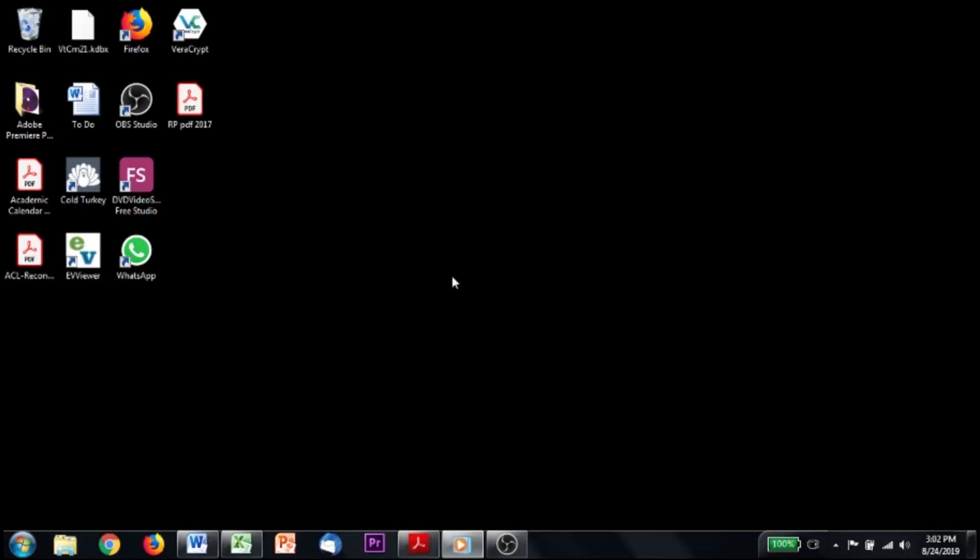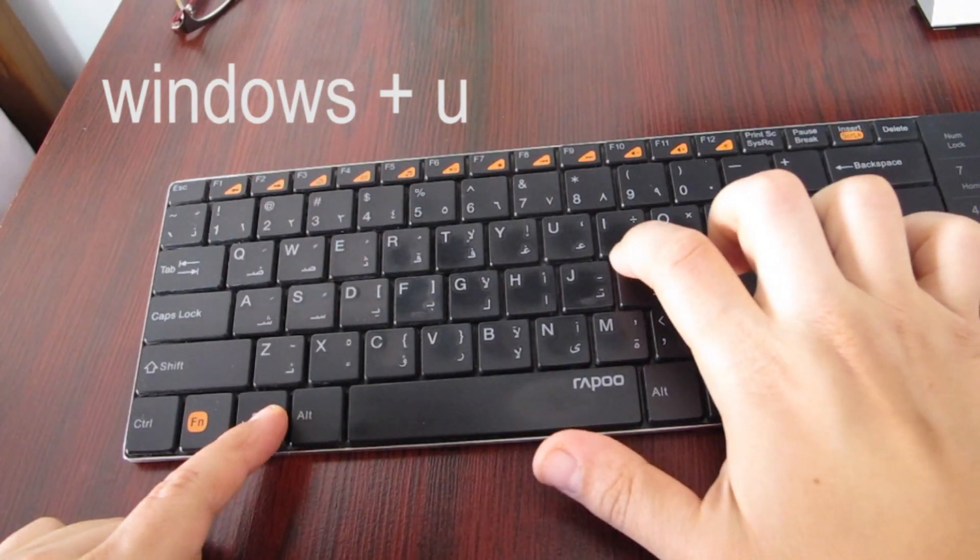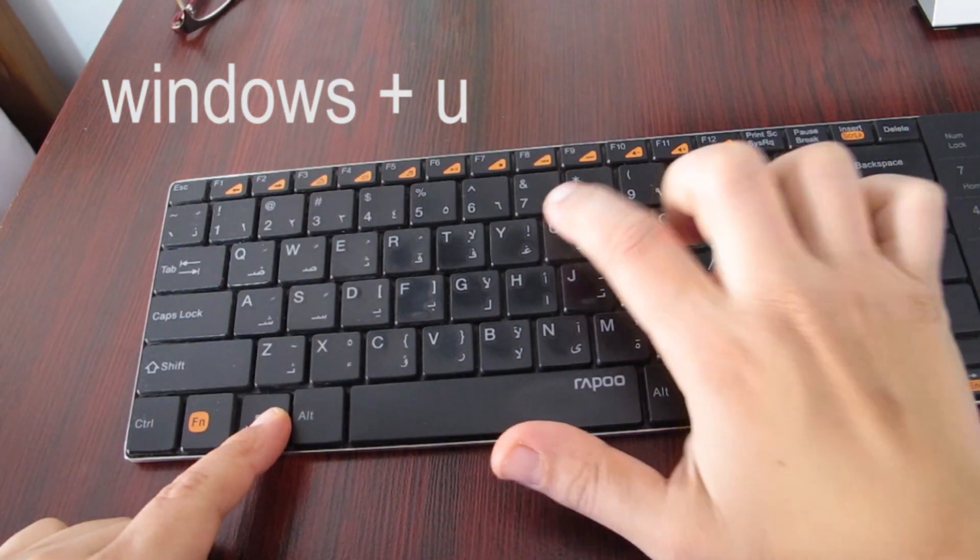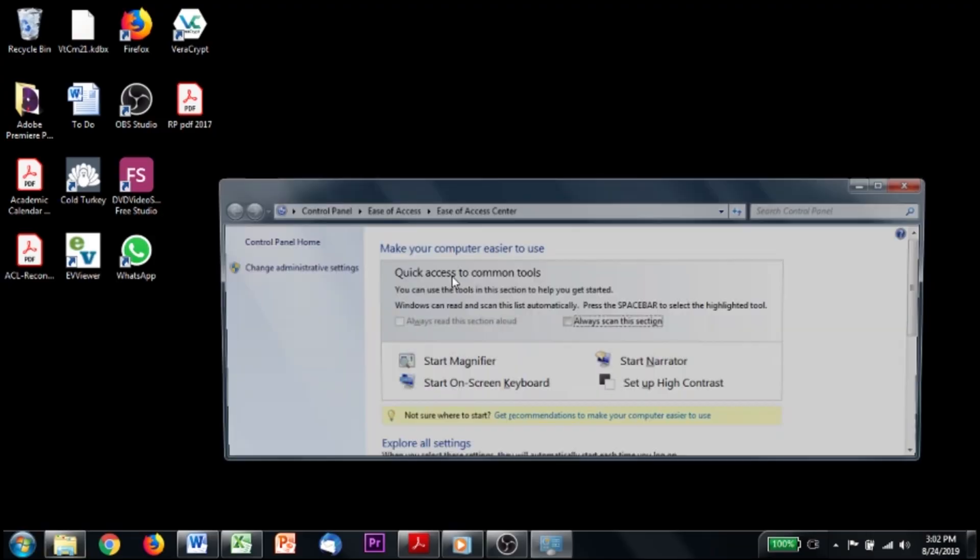And without further ado, let me take you through how I magnify things on my computer. Alright, so this is what your desktop will look like when you first start up. I usually have a black background because it makes it easier for me to see my icons. The first thing I would have to do in order to be able to use the computer at all is to hit the window and the U buttons.